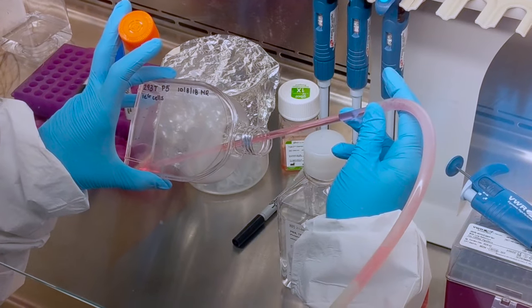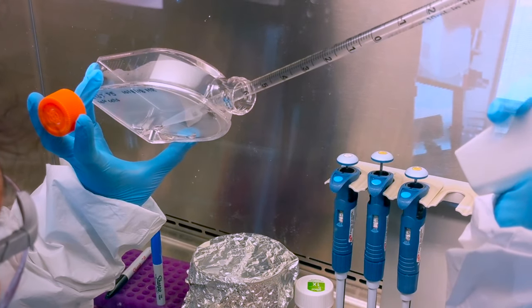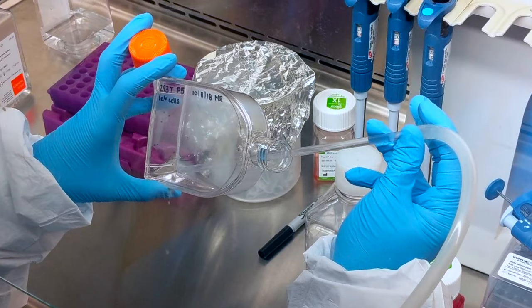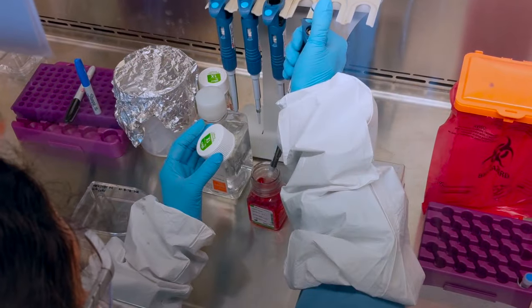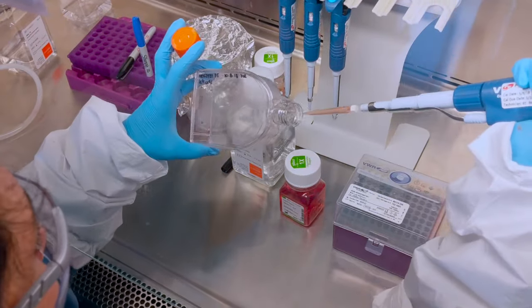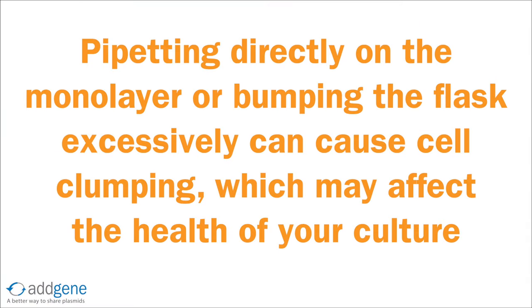Once growth procedures are established, users should take care to treat their cells gently. When you're ready to aspirate, place the pipette in a corner of the flask to prevent disrupting the cells. When trypsinizing or detaching your cells from the flask, do not add the enzyme directly to the monolayer and try not to excessively bump the flask. This can cause the cells to come off the surface of the flask in sheets of clumped cells rather than single cells.